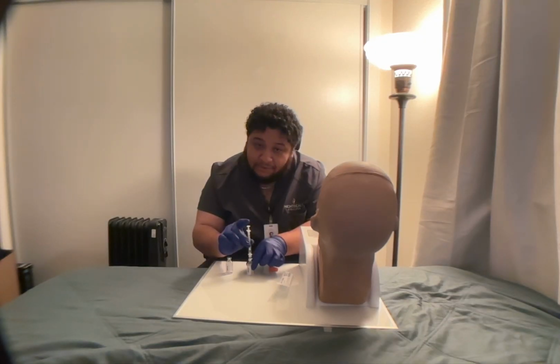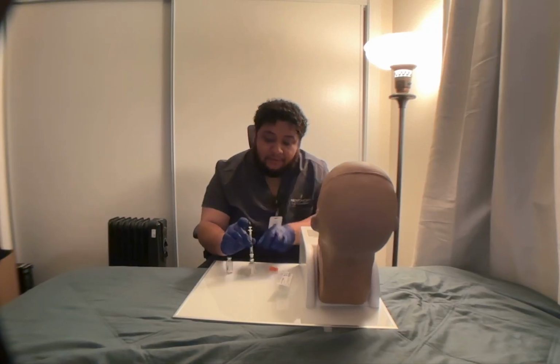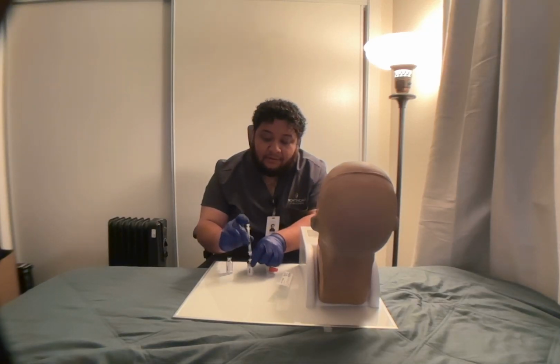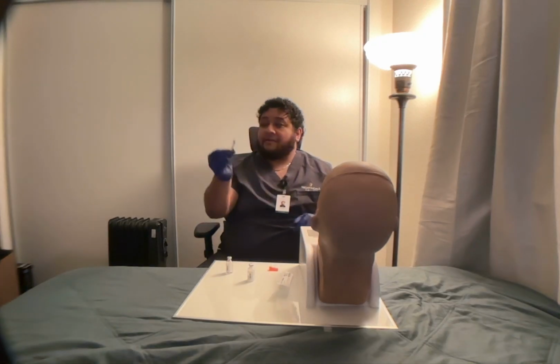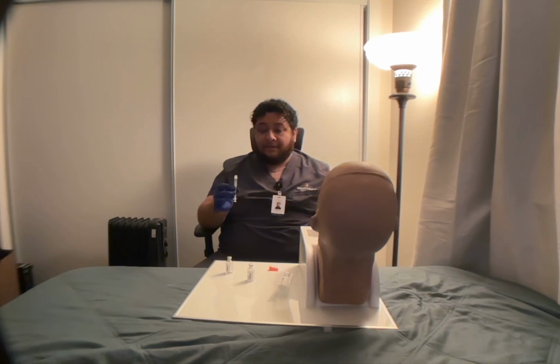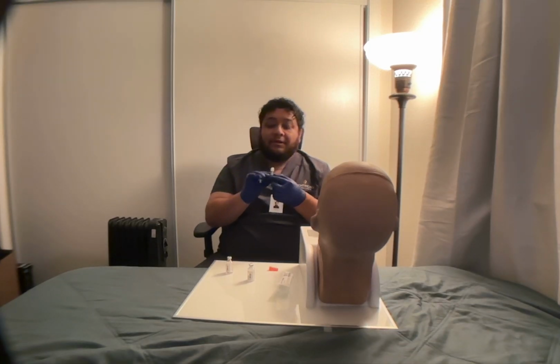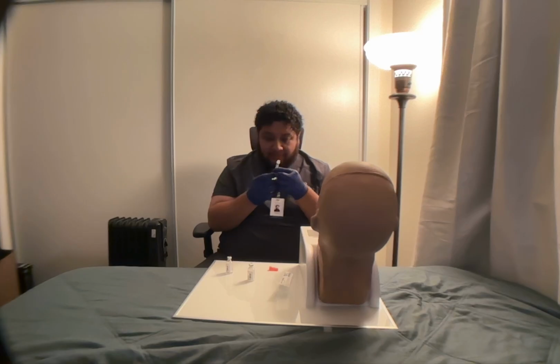Without getting any solution in the syringe, I'm going to push the plunger, like so. There we go. Just going to verify with the nurse and the camera that I injected the air into the vial. Now I'm going to draw 4 units into the syringe.